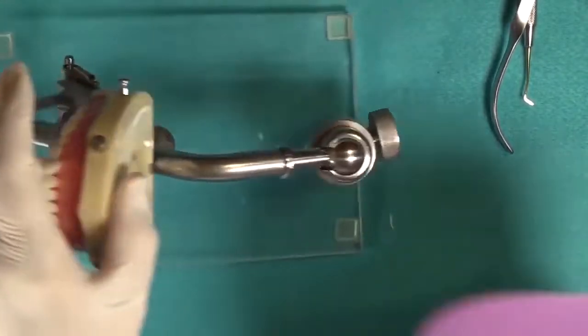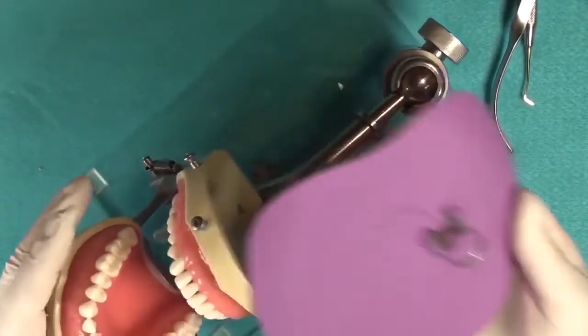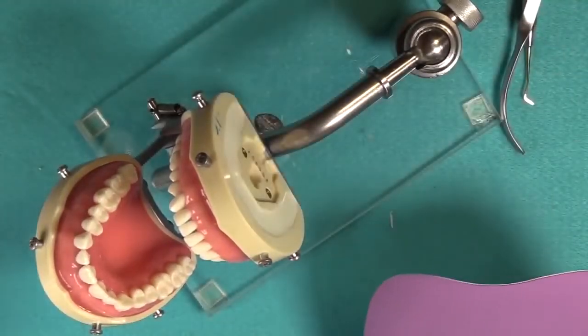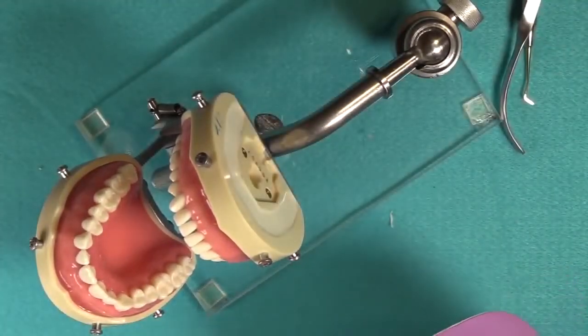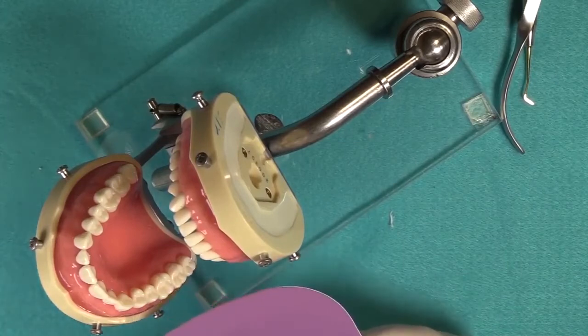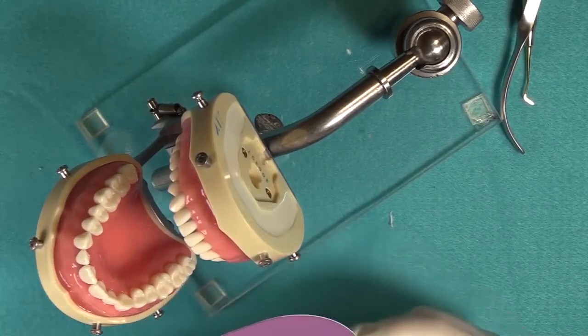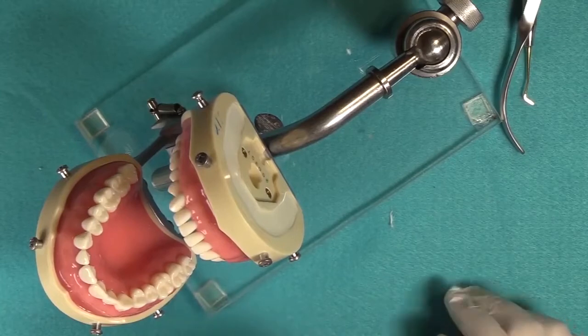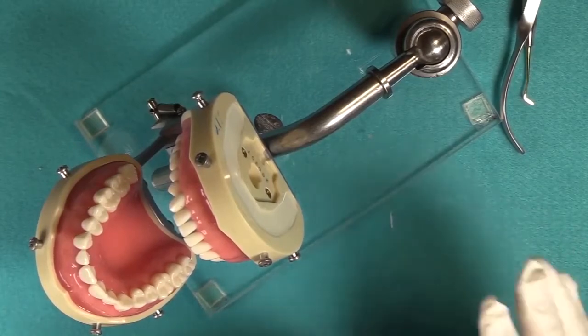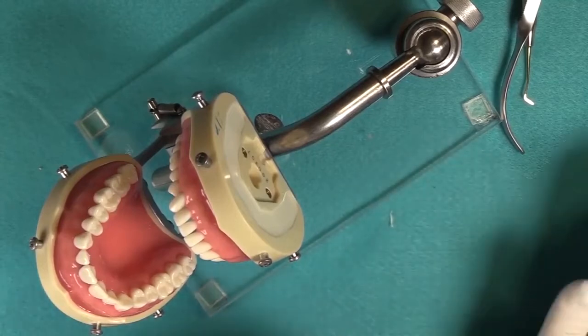And it's a good idea to explain to your patient what you're going to be doing. And the benefits of using dental dam is going to keep the material from going down their throats, and they're going to be much more comfortable. I think sometimes individuals are concerned about the fact that the patient can't breathe and that sort of thing. Well, that's not true. I mean, if they have a cold, that might be a problem.